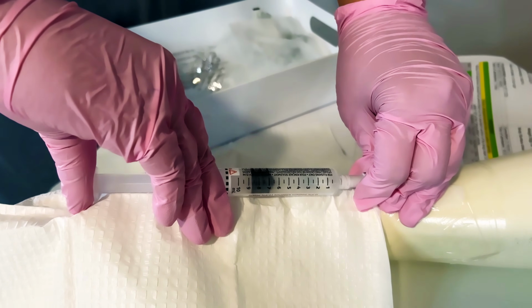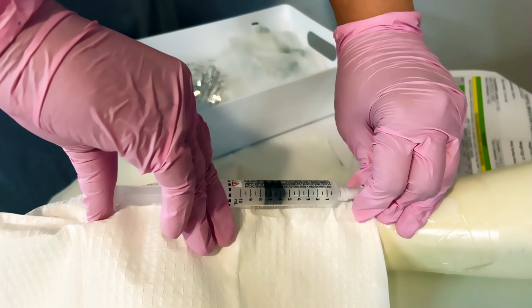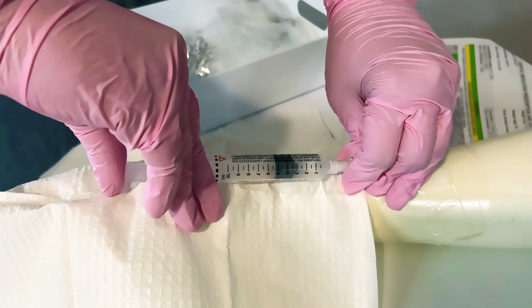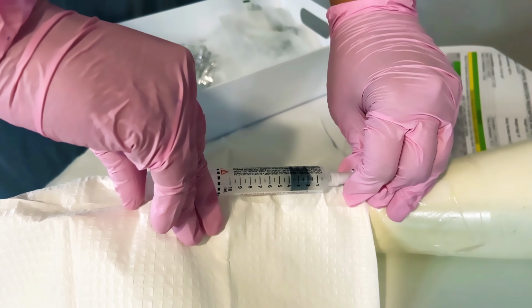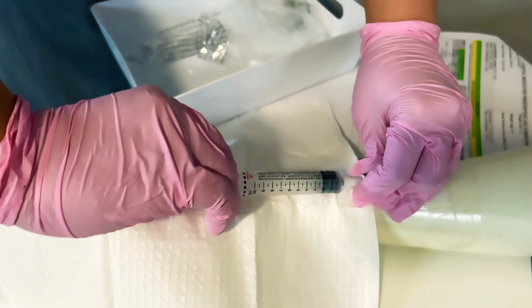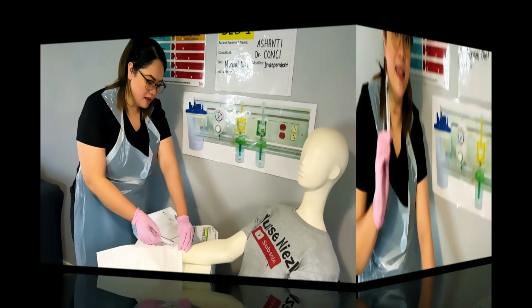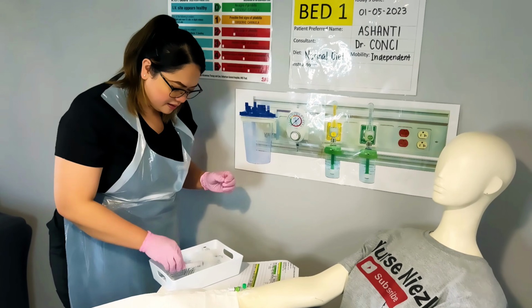Are you alright? Yes, I'm okay. Is there any pain? No pain at all. Okay. Start, stop, start, stop. Is there any pain? No pain at all. Start, stop, start, stop. Is there any pain? No pain at all. Okay. Start, stop, start, stop. Now, the last one, start, stop, and this is the time I can let go. Okay, so that's it. I'm going to put it here.